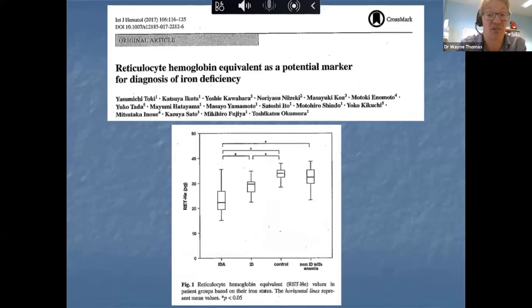normal population, because they are iron restricted, and therefore the reticulocytes, being that 5-day window of insight into the bone marrow, allows you to just concentrate on that very short window that are just coming out from the bone marrow. So that is not looking at all of them, so it's looking at a discrete population, but also it's a shorter period of change, isn't it? So if you make a change, you can actually look at that value.